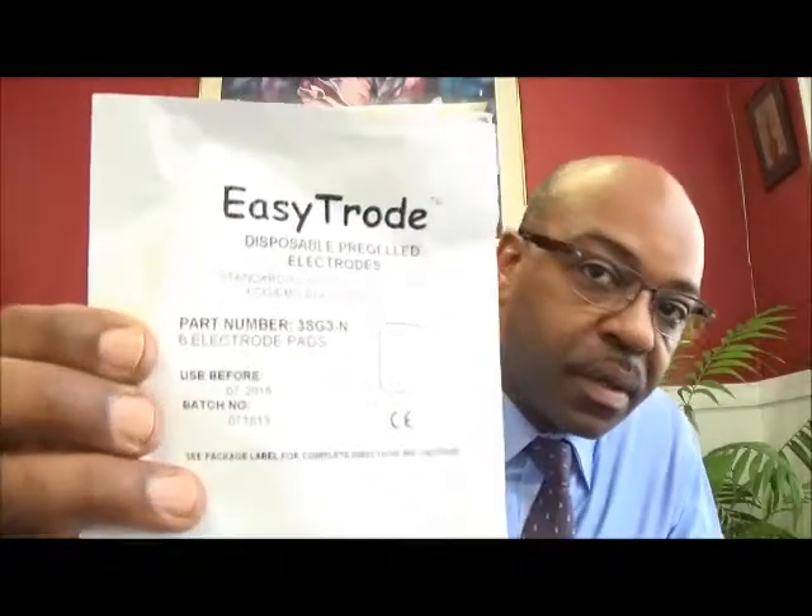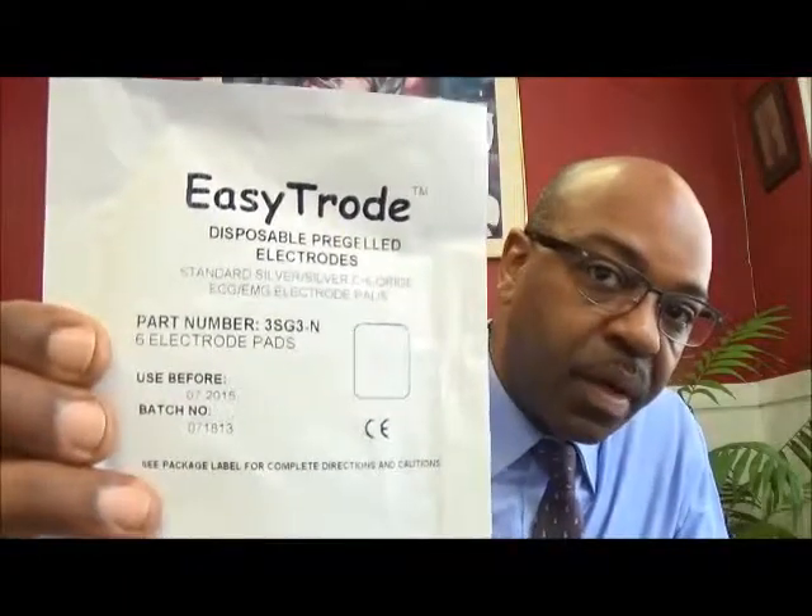Hello, this is Harry Campbell from Biofeedback Resources. I wanted to demonstrate a type of disposable EMG recording electrode. This is called the EasyTrode, part number 3SG3-N, and it's a disposable electrode.